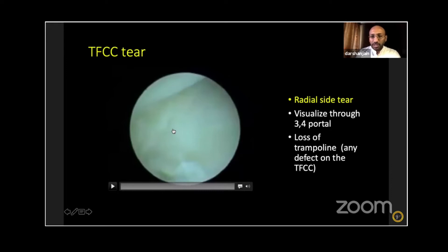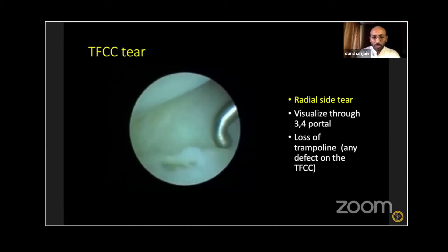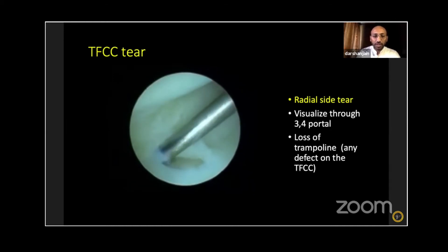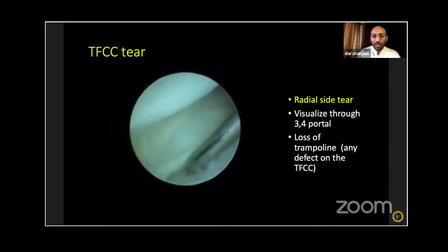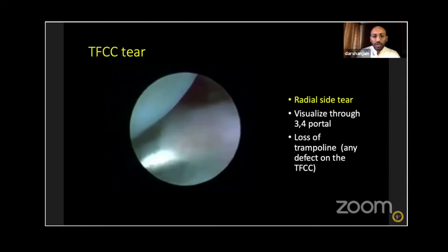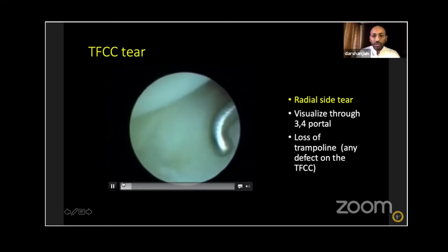This is a TFCC tear where you are visualizing from the 3-4 portal and checking for the trampoline effect. There are various classifications, but I'm showing one on the radial side where you can see the ulnar head through the tear. Loss of the trampoline effect is the key identifying technique to determine if the TFCC is torn on the radial side.